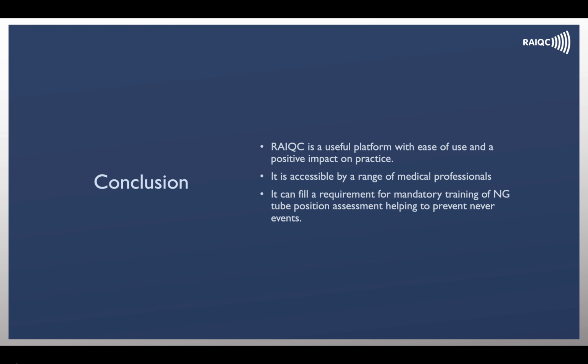We believe that RAIQC is a useful platform with ease of use and a positive impact on practice. It's accessible by a range of medical professionals and can be used for mandatory training of NG tube position assessment, helping to prevent never events in the future.